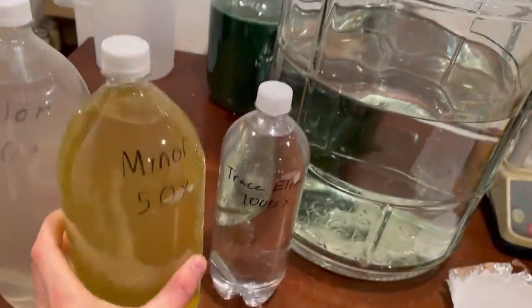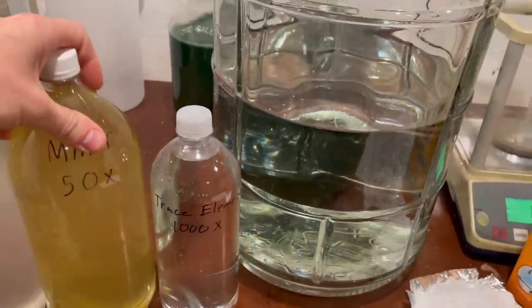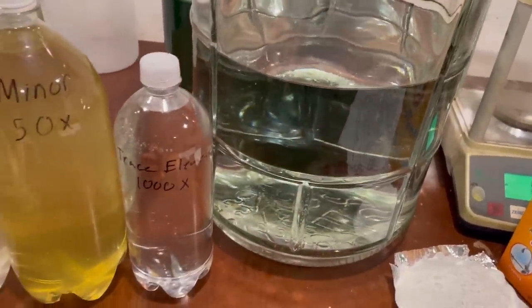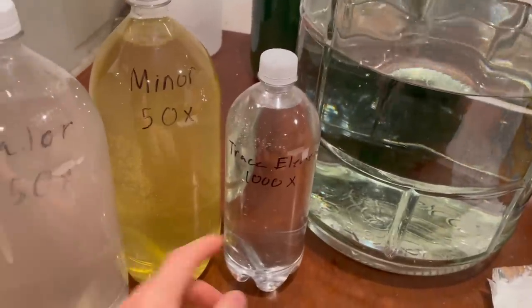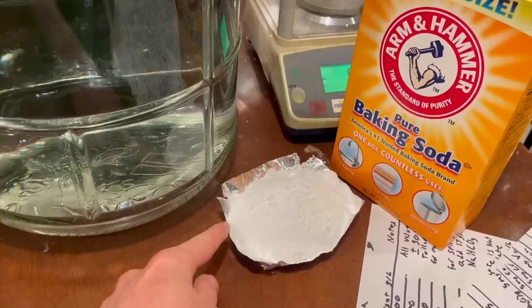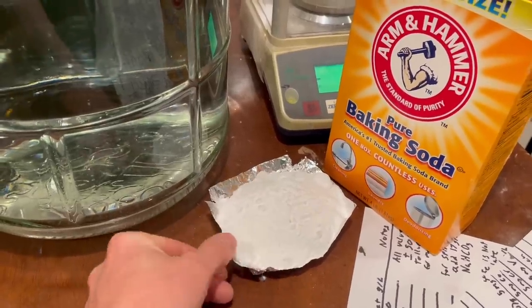There it is — all dissolved. Very little sediment, only from the chemicals not being perfectly pure. Now I'm ready to make the media. I've got 12 liters of water, and I'm going to add 250 milliliters of each of the major solutions, 12 milliliters of the trace solution, and 204 grams of baking soda.